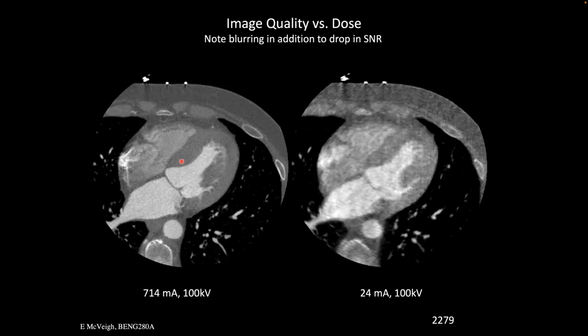So the signal could run out. Oh, I see. So, well, an X-ray tube, which is the source of your X-rays, right? It's like a light bulb, and you use it so many times and eventually it just does fail, right? And that's the most expensive thing that can usually happen in a CT scanner, when it fails, is that you just need a new X-ray tube, but they're not cheap. They're like 50 grand, 100 grand, 200 grand, depending on how sophisticated the tube is.